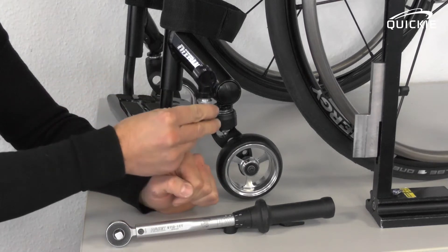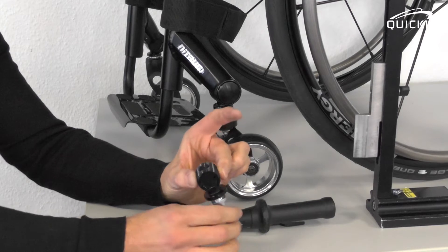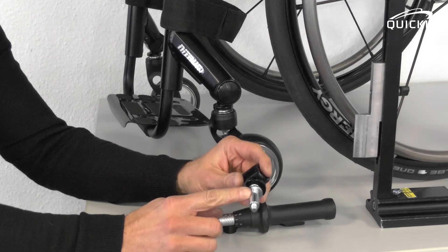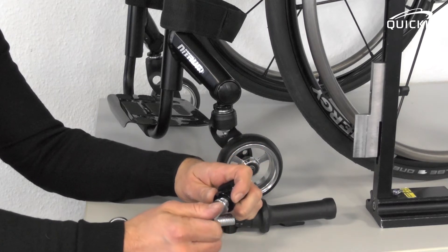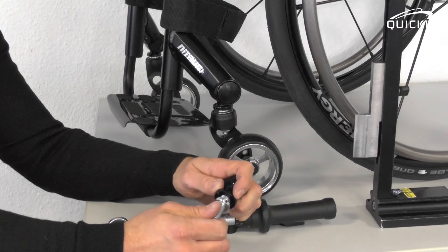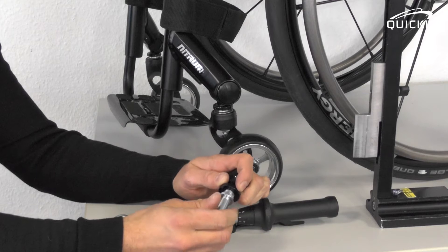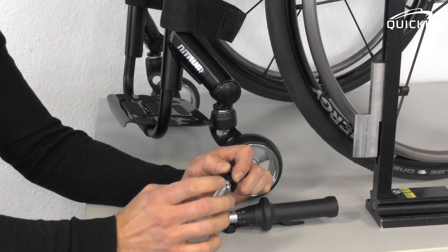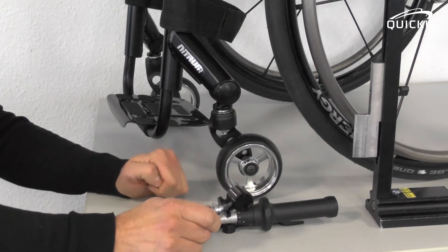Here's what's hidden inside the caster housing. We have what we call the barrel, which lets you adjust the caster fork angle. And then we have what we call the caster stem, which has a thread on it. If you turn it counter-clockwise, it will add height to the caster. If you turn it clockwise, it will reduce height. A 360-degree rotation is always one millimeter of height on the caster wheel.